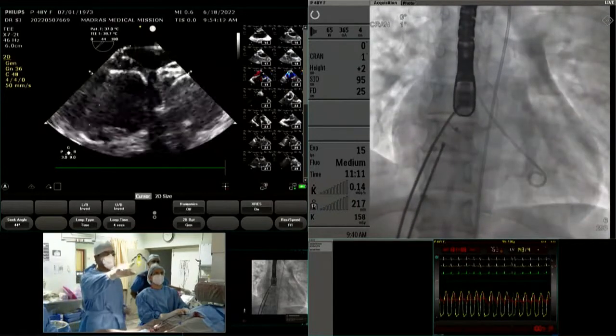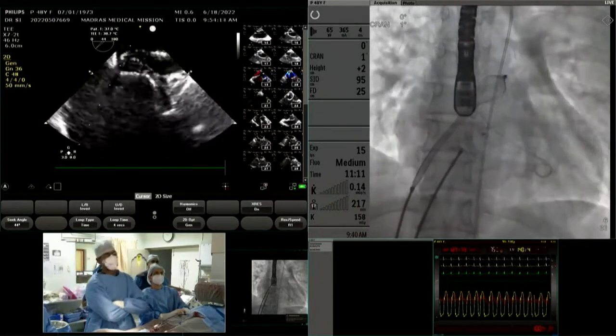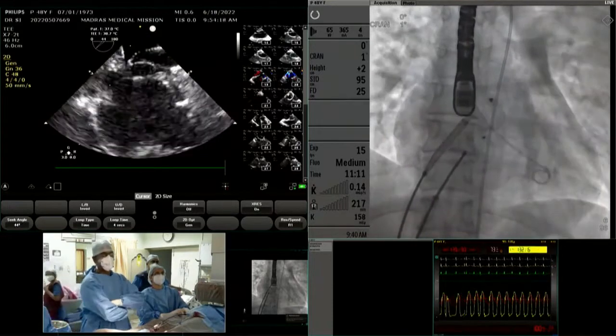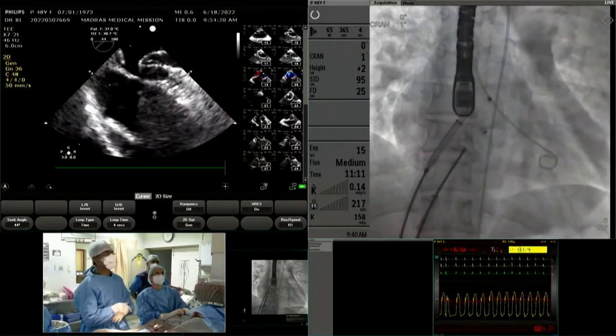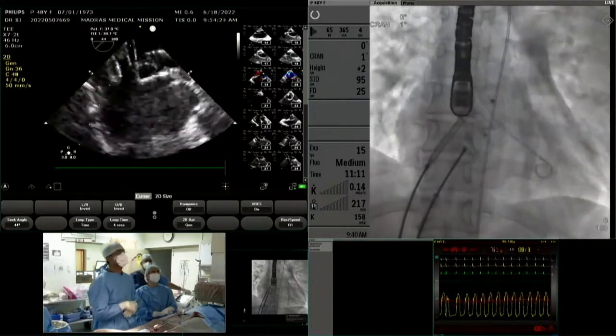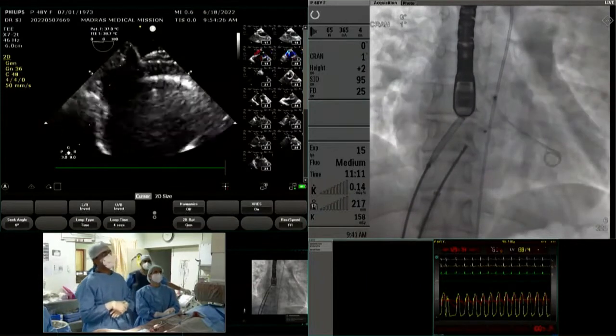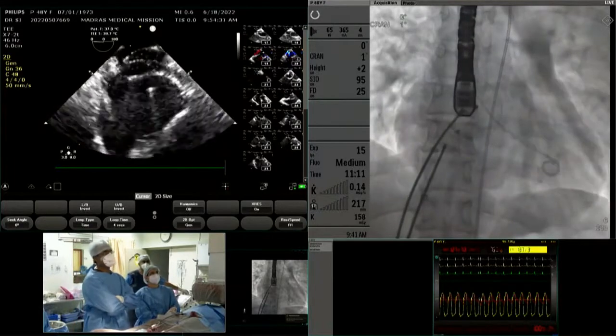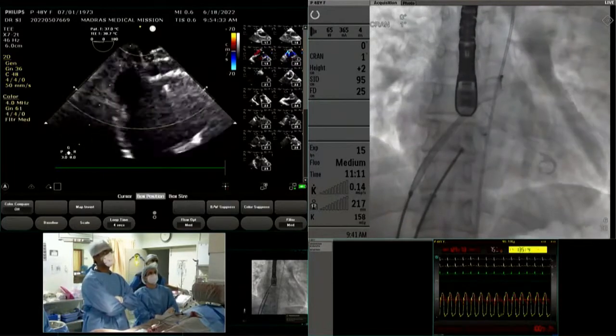Yeah, it is being shown, Pramod. Nageshwar, it's being shown again and again. Yes. What I did is being shown. Yes. So you can see the AP view. The larger defect, LA disc is deployed. Okay. Yes, sir. So now Pramod is showing the overlapping part of the two devices. Color now, Pramod. Yes, sir.